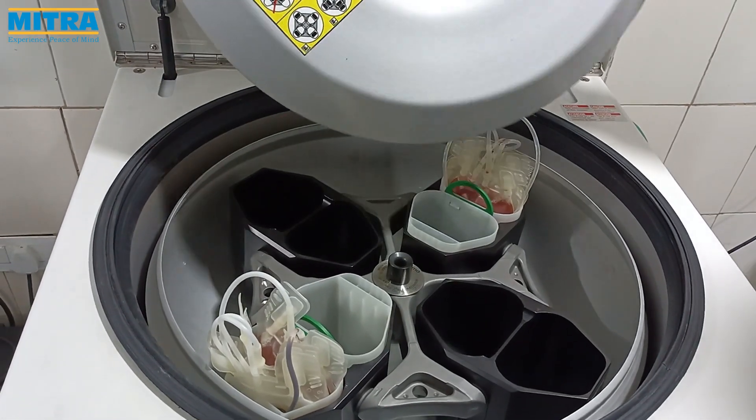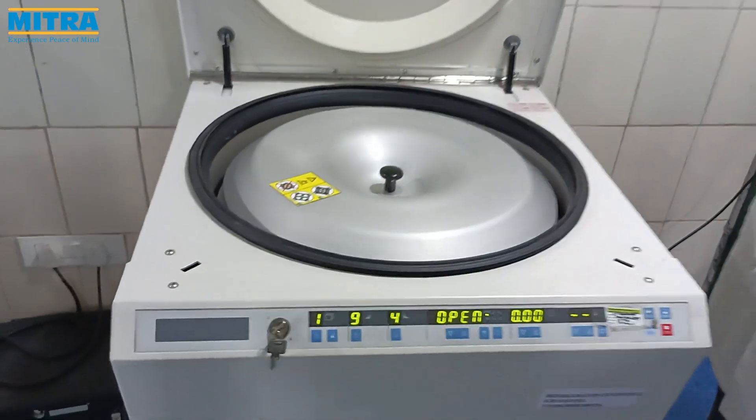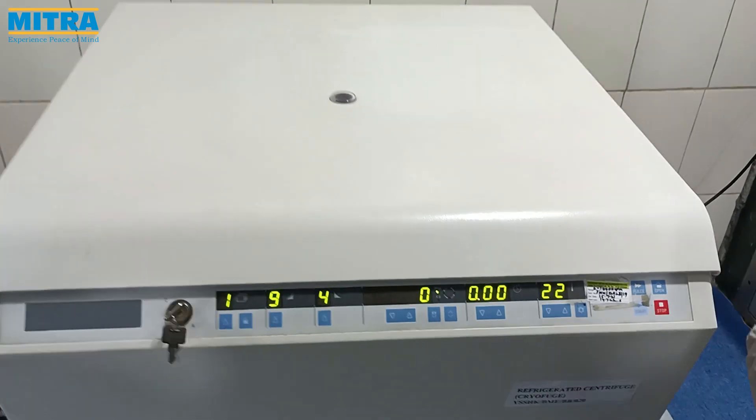Close the inner lid, then close the outer lid. Now choose the desirable program and press start.